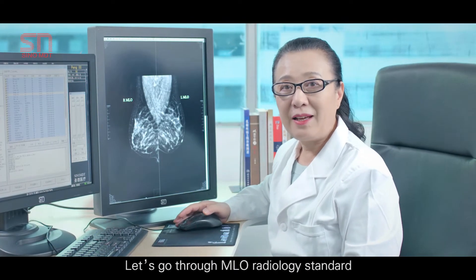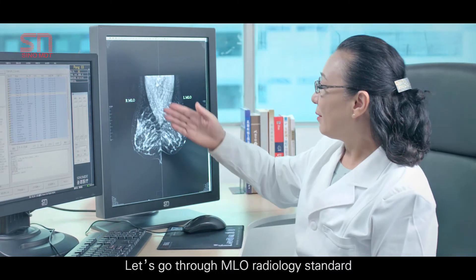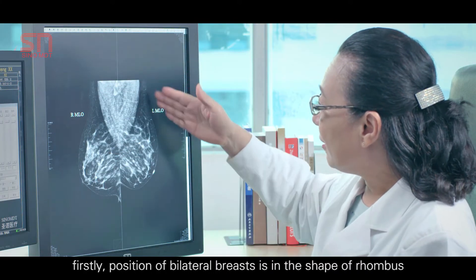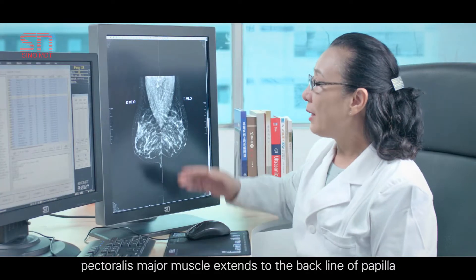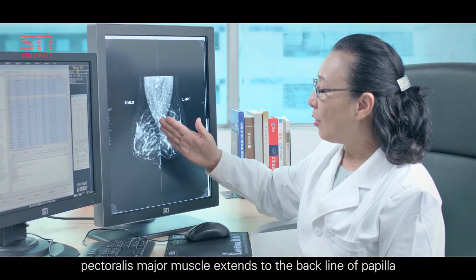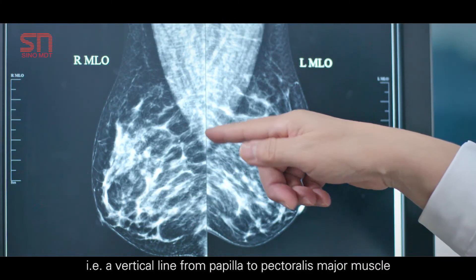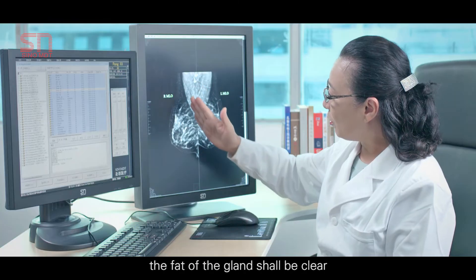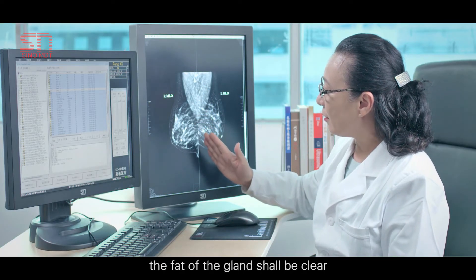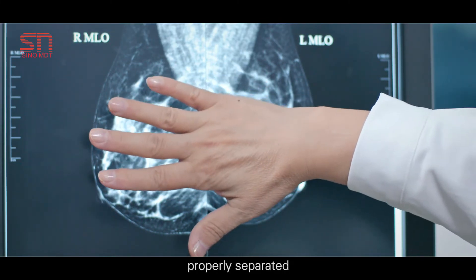Let's go through the MLO radiology standard. First, the bilateral breasts should be positioned in the shape of a rhombus. The pectoralis major muscle extends to the back line of the papilla — a vertical line from the papilla to the pectoralis major muscle. The fat of the gland shall be clear, and the gland tissue shall be stretched and properly separated.